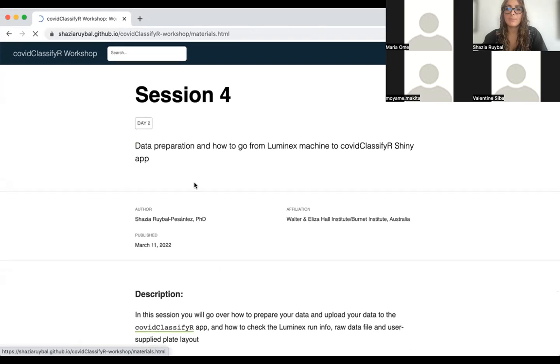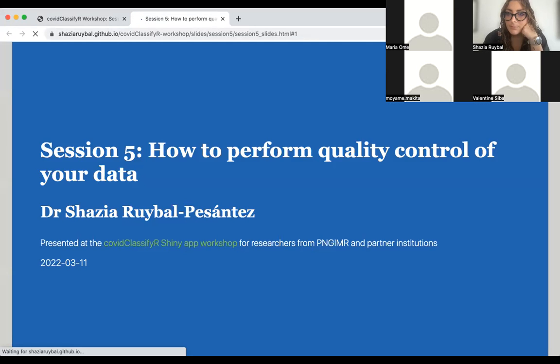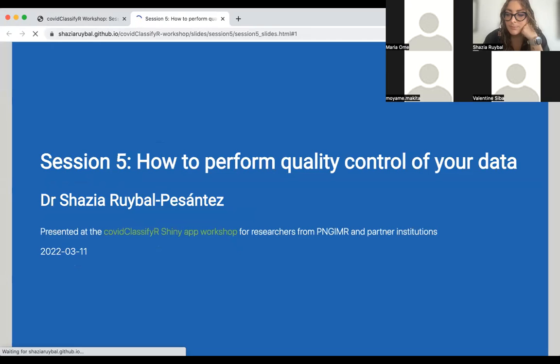If you're trying to optimize an experiment, maybe you'll just edit as unknown and then make some notes underneath.